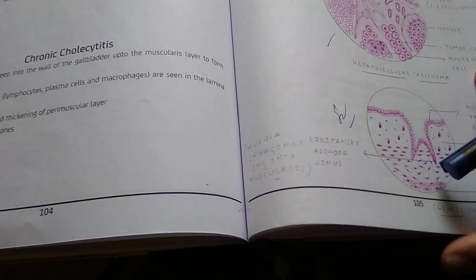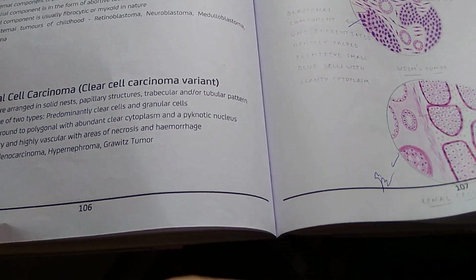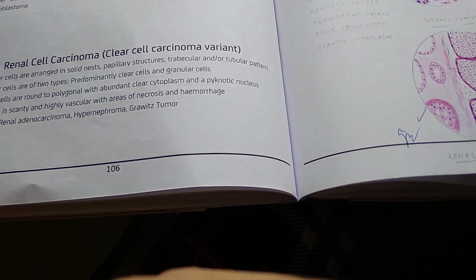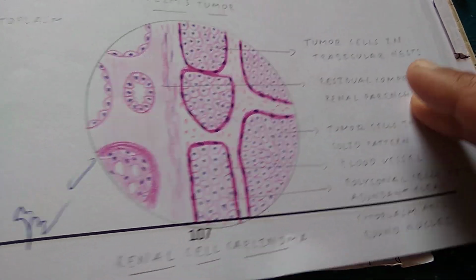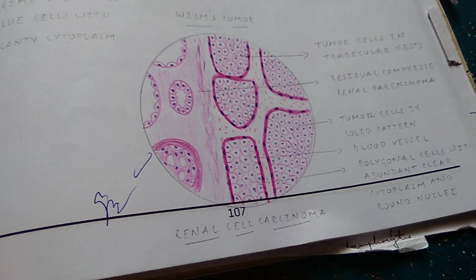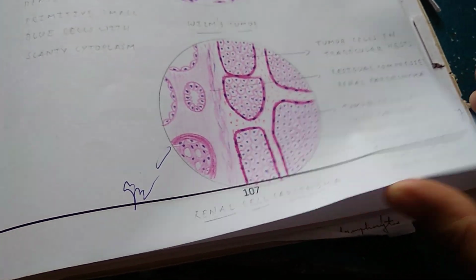Okay. Adenocarcinoma, stomach, chronic cholecystitis. What is this? Renal cell carcinoma or clear cell carcinoma variant. So you should see a lot of clear cells here. Yes, we can see a lot of clear cells. And I think this side is the normal. What do you say? And this side is the abnormal, is it? Didn't put any labeling on this side. Okay.